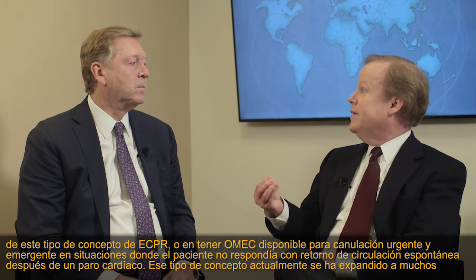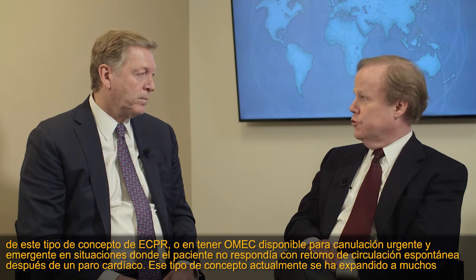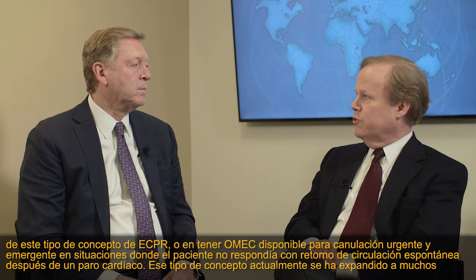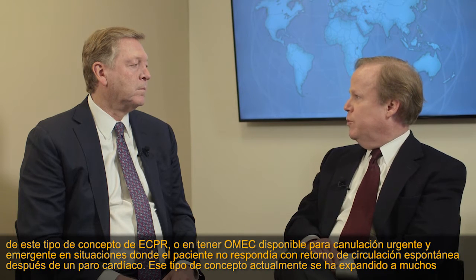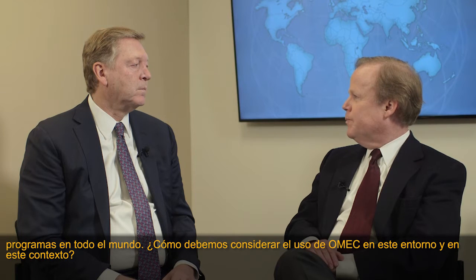David, could we turn now to the use of ECMO in the cardiac intensive care unit environment in particular? As you well know, you were one of the pioneers of this concept of ECPR, or having ECMO available for urgent and emergent cannulation in situations where the patient wasn't responding with return of spontaneous circulation after cardiac arrest. Now that concept has spread to many programs around the world. How should we be thinking about the use of ECMO in this environment and in this context?